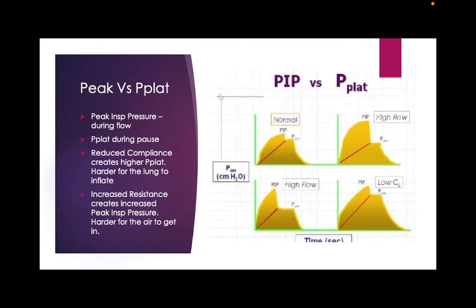One of them is Inspiratory Hold. So if you hold that down, you'll see your peak and then your plateau. If you want to see the number, hit additional values on the bottom right corner of the screen, and it'll give you a line for it, and it'll tell you what it is, okay? So when you're looking at the vents tomorrow, you can do that.